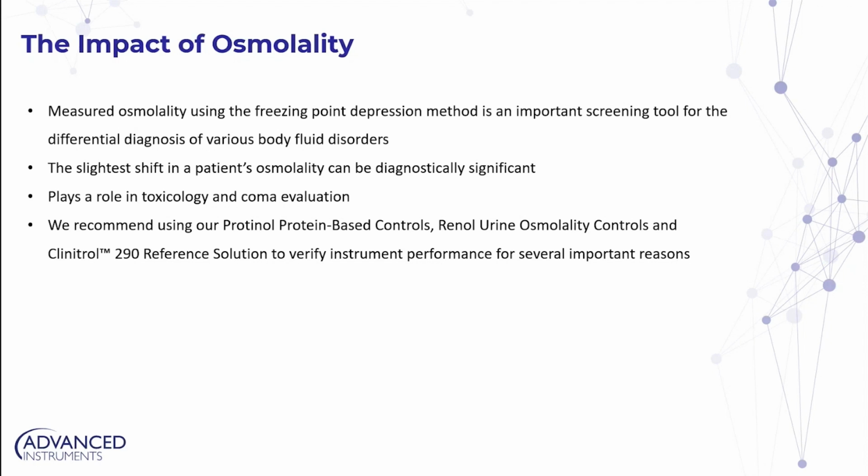Even a slight shift in the osmolality of a patient's sample can be diagnostically significant, making a robust osmometer quality control program critically important. This will be our focus for our discussion today.